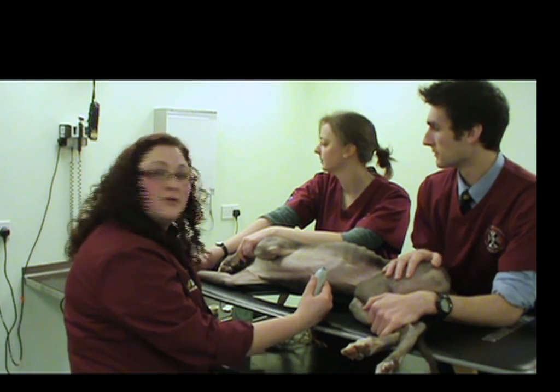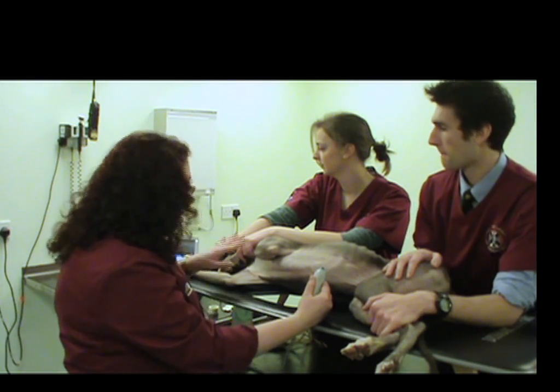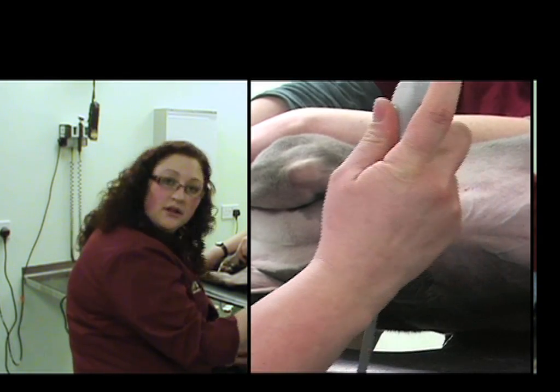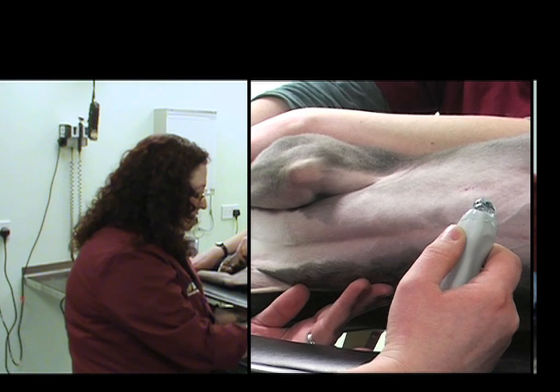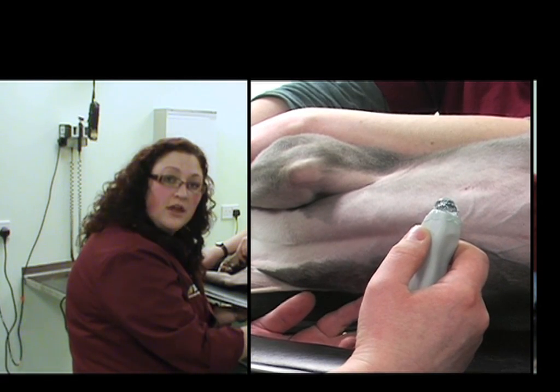Now we're ready to get started performing our echo exam. Our patient has been prepared, well positioned, and we're ready to begin. My thumb is on the thumb notch, and we've applied a little bit of extra gel just to ensure we have good contact. I'll feel for the apex beat and place the probe in the intercostal space just over the apex beat.